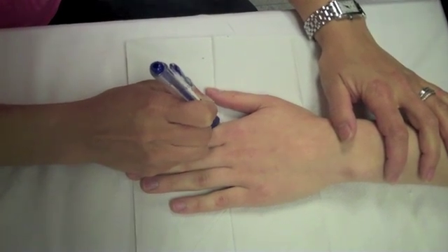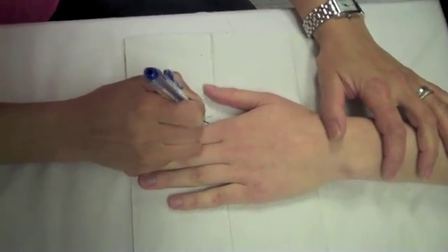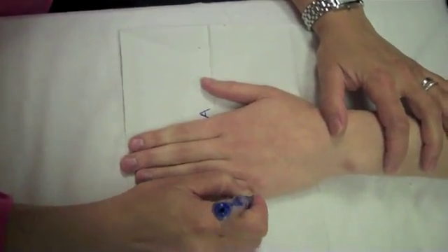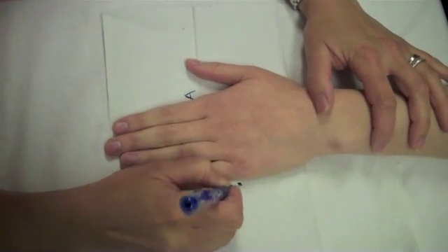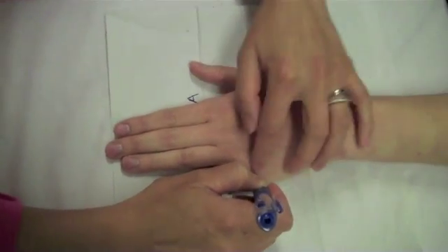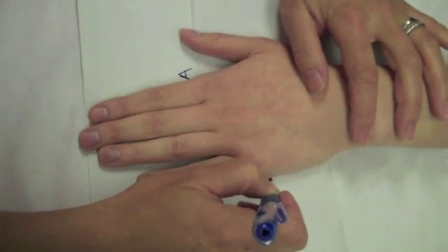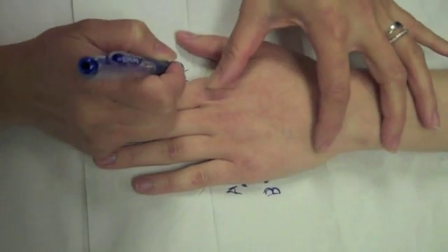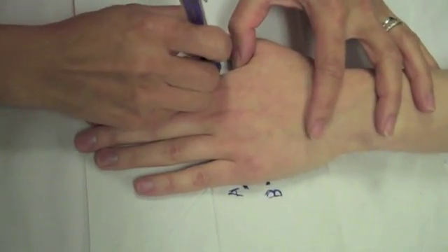Place the patient's hand palm down on a flat surface. Next, mark an A by the proximal end of the 2nd MCP joint. Mark another A by the proximal end of the 5th MCP joint. Then mark a B by the distal end of the 5th MCP joint and the distal end of the 2nd MCP joint.